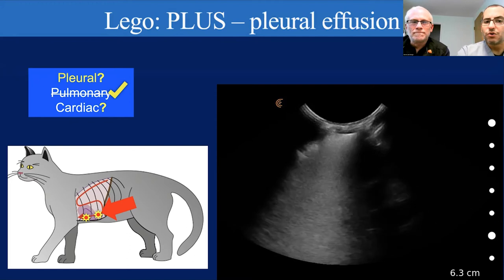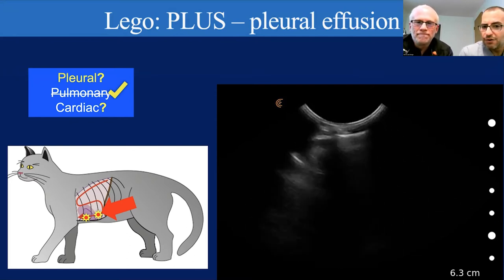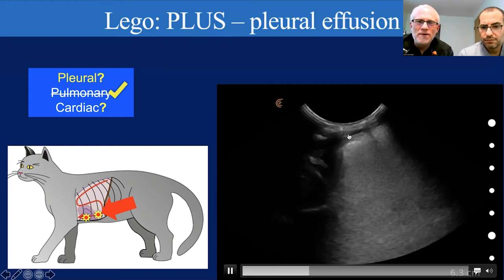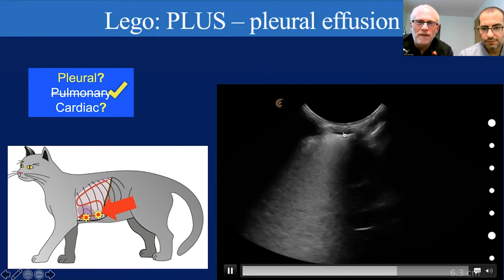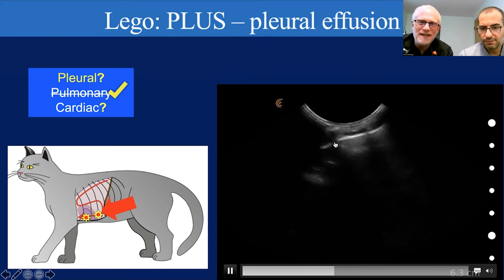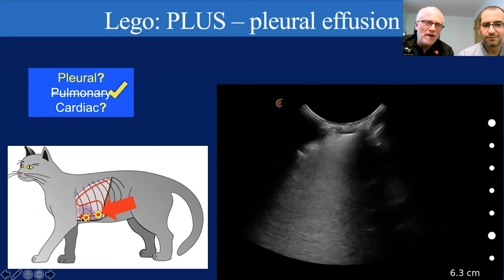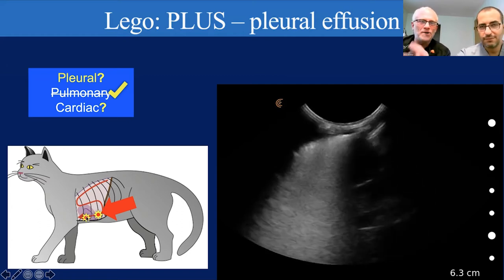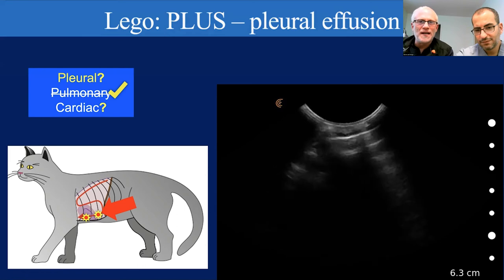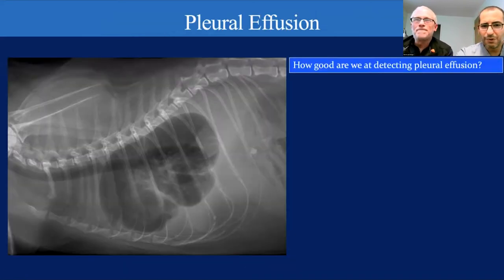Now, LEGO, we're wondering if there was a little bit of pleural effusion. So what do I need to do here, Dr. Boysen? Yeah, so again, I'm looking at this image here. This is our Clarius image that we have from LEGO. And I'm seeing those increased B lines, consolidation. I'm looking there, I'm thinking, is there a little bit of separation there? Is there a little bit of fluid? We are actually quite ventral down here, Dr. Chalhoub, but we've got the probe perpendicular to the ribs and we're sitting about the costochondral junction. Is there a better way for us to look for pleural fluid, and how good are we at it, Dr. Chalhoub? Well, I would think it would be a no-brainer. So that's why I don't understand why we're having so much trouble even detecting that fluid there, Dr. Boysen.